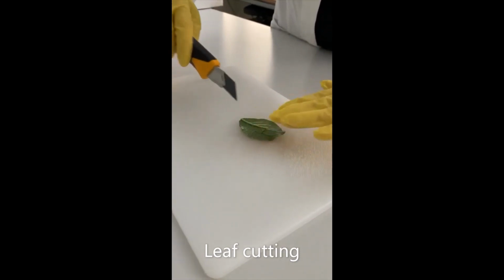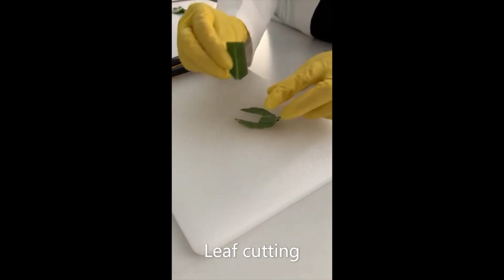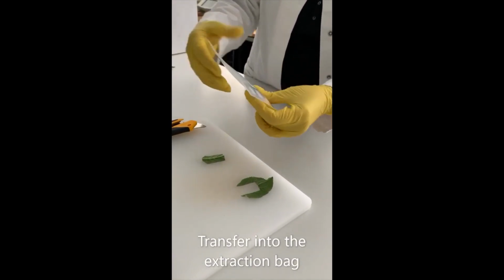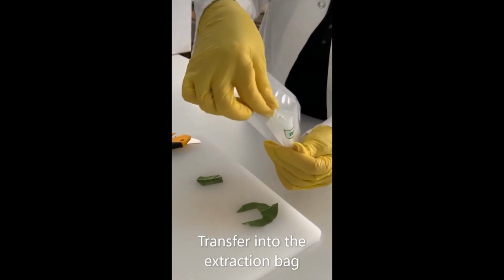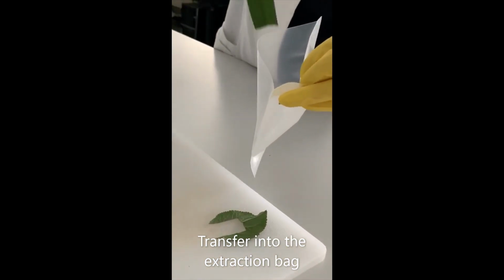So the recommended sample size for Plumpox virus testing is about the size of a 2 euro coin. It's about 8 square centimeters, and this is what you see, what I was cutting here. So we take the phloem tissue basically of the basis of the leaf, and we add this piece of leaf into an extraction bag. This extraction bag has an intermediate layer, which is semi-permeable.